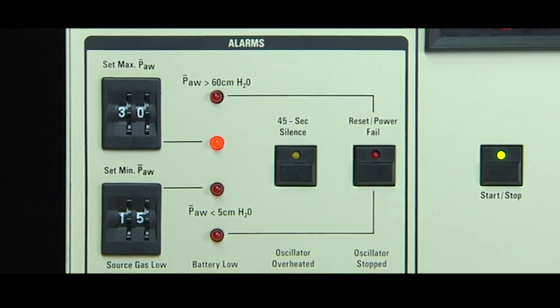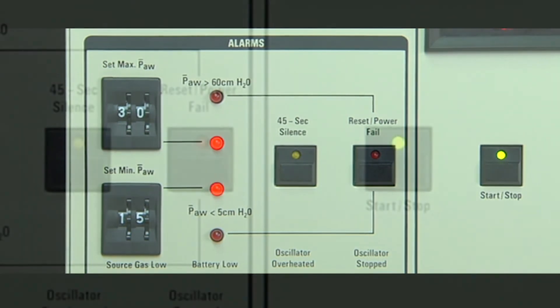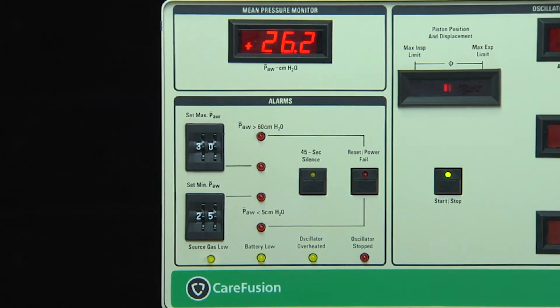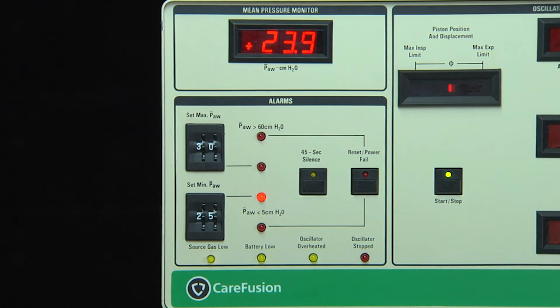In the event that the high mean airway pressure alarm condition persists, the limit valve will continue to cycle until the fault condition is resolved. Pressing the reset power fail button will reset the visual alarm. If the alarm for the set minimum mean airway pressure is triggered, audible and visual alarms are activated and automatically reset upon resolution of the fault condition.